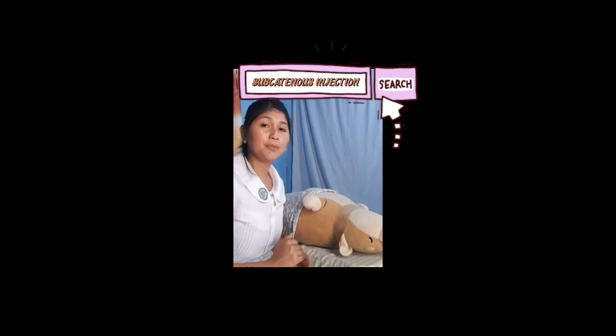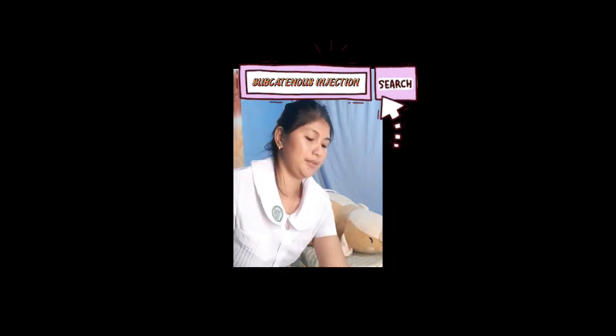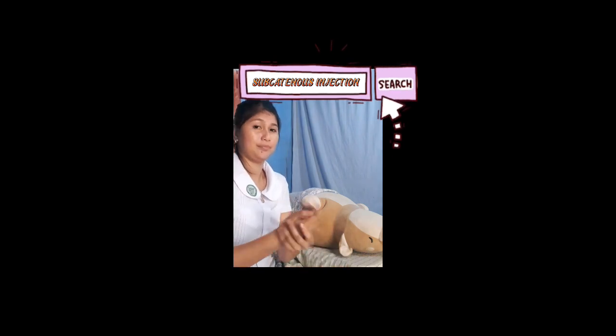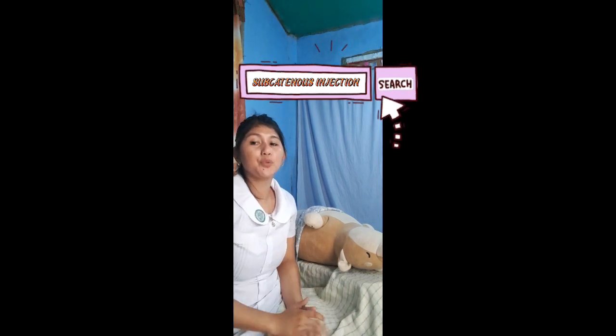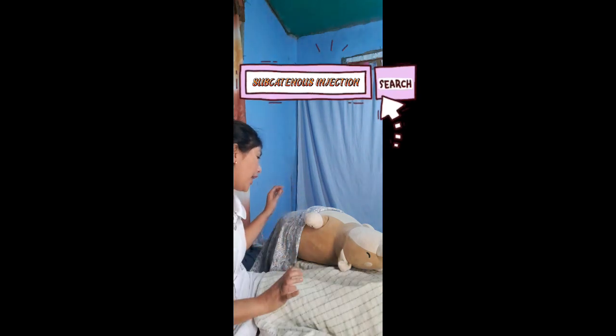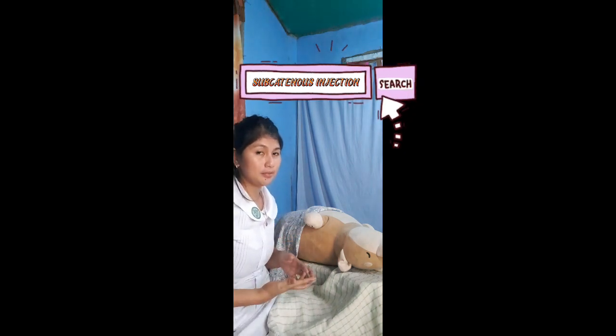Before that, I am going to perform hand hygiene to deter the spread of microorganisms and also prepare all of my equipment. So I have here all my equipment, and I will perform hand hygiene for the next procedure. Now determine the site to be used and expose the potential injection site. I am going to expose the abdomen of the patient.